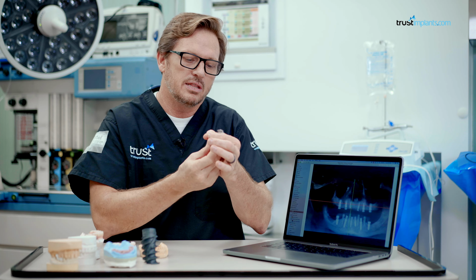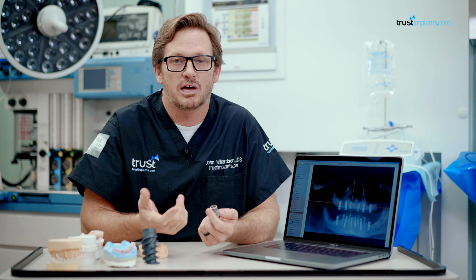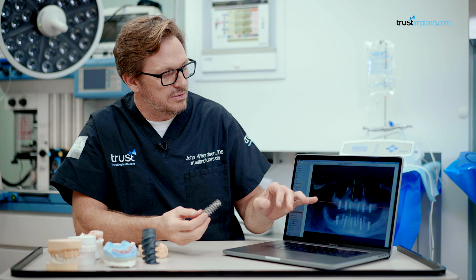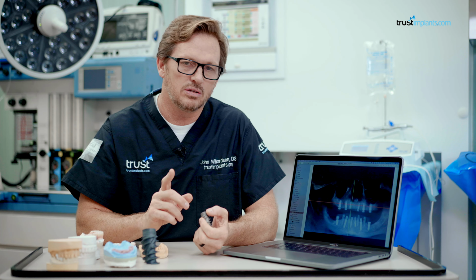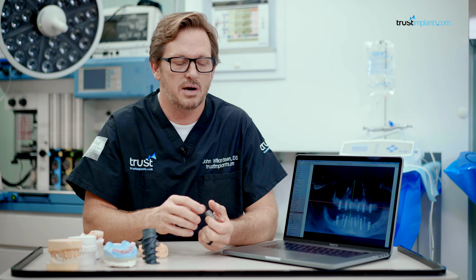As well as I get very high torque values on a situation where the bone isn't quite as dense, because I'm engaging as much bone as possible as I'm placing this implant into the hole, or the osteotomy. The other benefit is I don't have to remove a lot of bone. Like in this case, there's this drilling sequence, and we go from like a 2mm drill to a 2.5 to a 2.8 and increase the diameter of the hole slowly, but each time I go with the drill, I'm removing bone. And our goal is to minimize removal of any bone if possible.